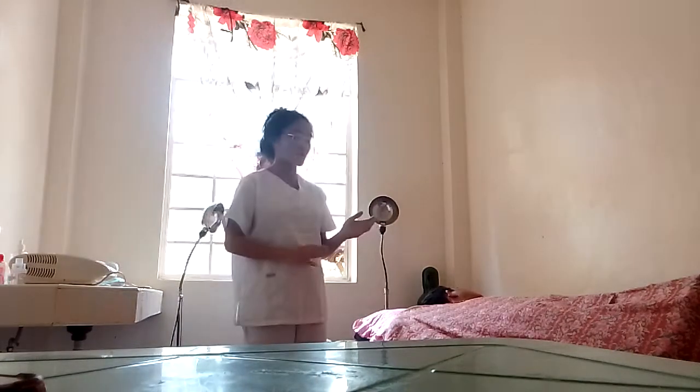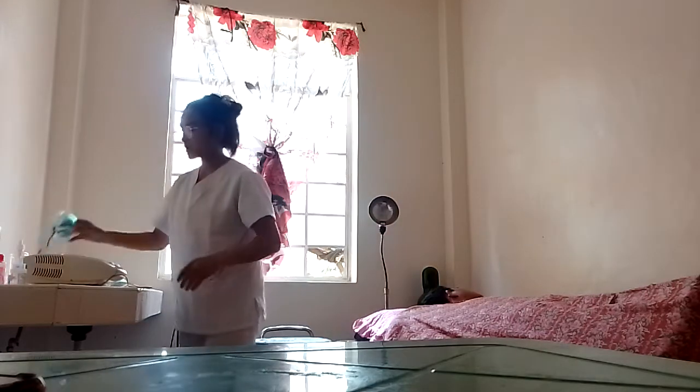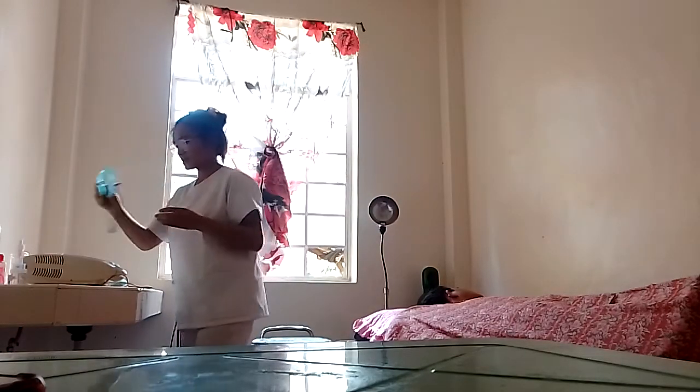Okay, so the next thing that we will do is we need to assemble all the needed equipment for oxygen therapy. So I have here the compressor or the air machine. I also have here the mask, thin plastic tubing.